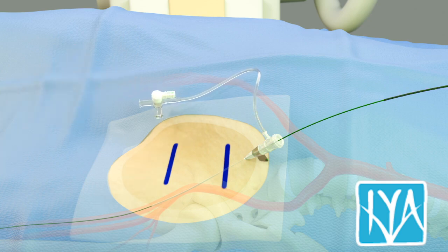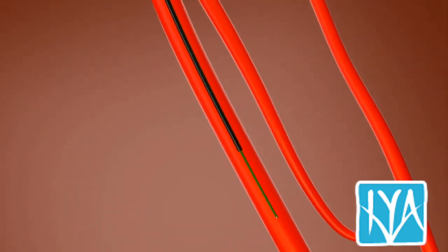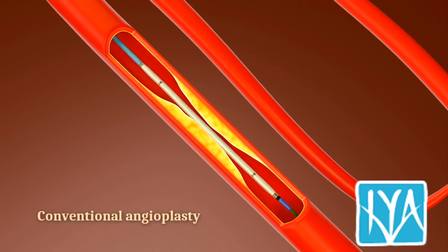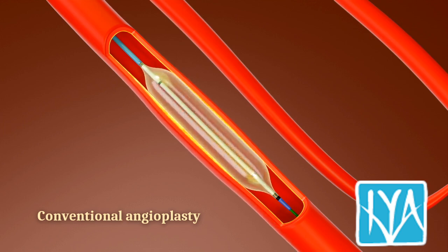An angled catheter is then advanced over the wire, through the sheath, and into the superficial femoral artery to cross the narrowed area and pass beyond the atherosclerotic lesion. The catheter is removed, and an angiogram is performed to assess the nature of the narrowing and determine the appropriate intervention. 4 common interventions are considered based on the findings.